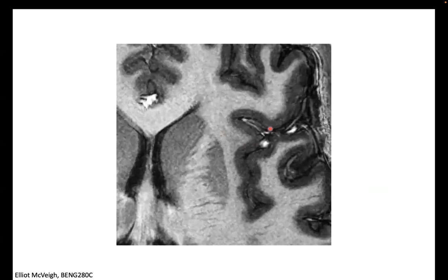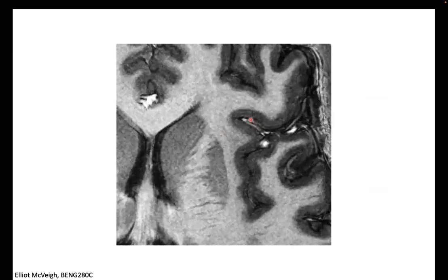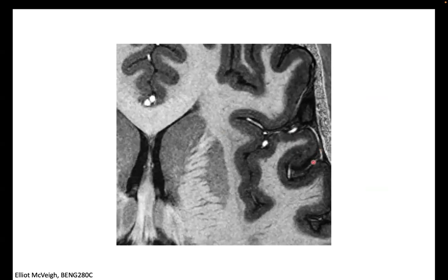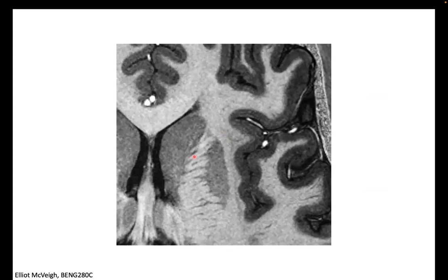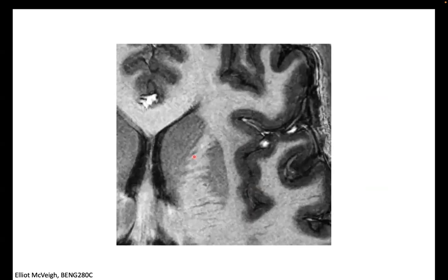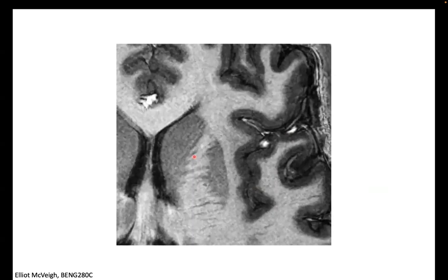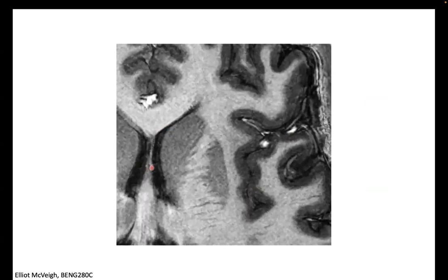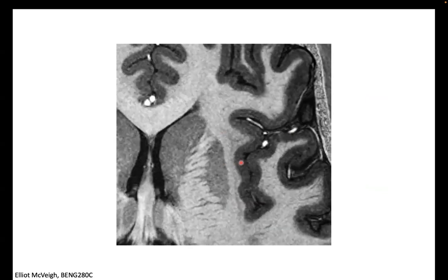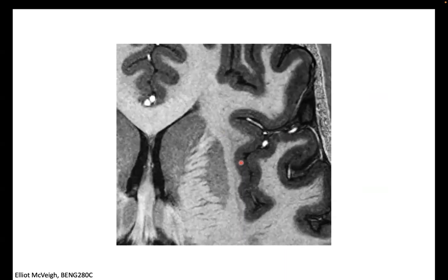So it's cyclical. So if you cardiac gate such that you get it at the same phase every time, then it goes back to this really crystal clear signal. So as I was saying before, as your spatial resolution goes up, you basically have to motion correct everything or take it into account. But look at the impressive detail of structures like this in the brain. And this is data taken at 7 Tesla in a live human brain. Remarkable pictures.